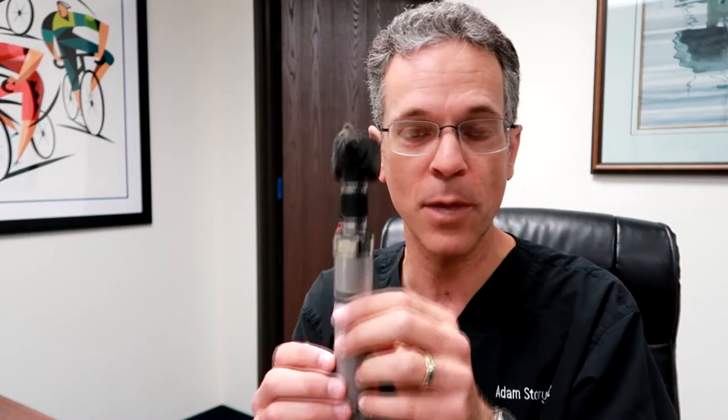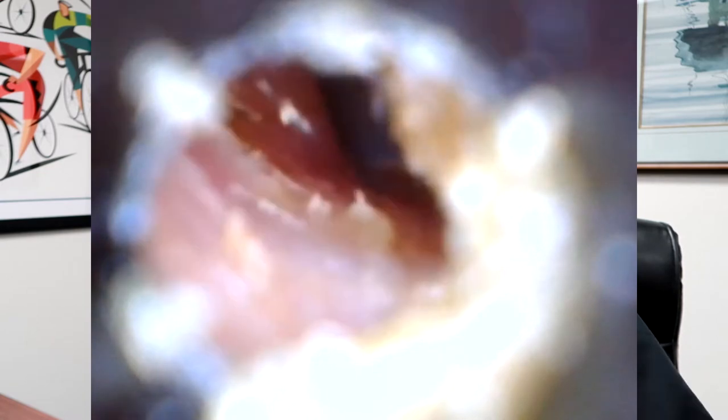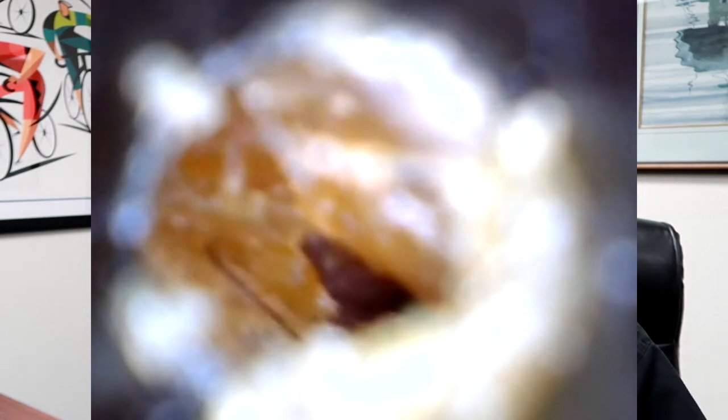In this video, I'm going to show you exactly how to look inside your own ear or your child's ear. If you've ever gone to the doctor and the doctor uses one of these — an otoscope — what he's doing is he puts this thing on the inside of your ear and then you can actually see through a little magnifying glass. The doctor can look and see what's going on inside the ear, whether you have an ear infection, too much wax, or a number of other things.